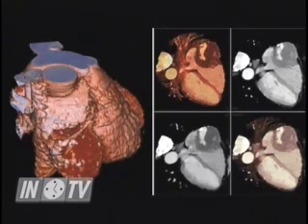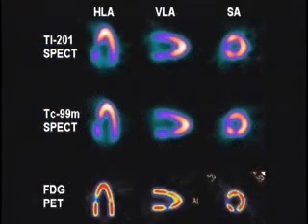Mm-hmm. Okay. Let's see, I think now we're moving on to SPECT. So the next slide. Now this is a gestalt here. You're going to have to tell us what we're looking at. So this is an example of what I was saying, the actual physiology. This is actually a radioisotope that is injected in the vein of a patient, and they lie under a camera. It's a non-invasive test, but is one of the few that actually show the uptake by the actual cellular function of the cardiac muscle cells. And the ones that are receiving enough blood flow will take it up, and then you compare the stress images to the rest images.